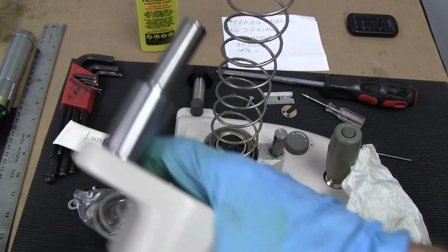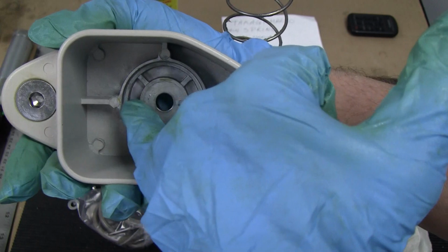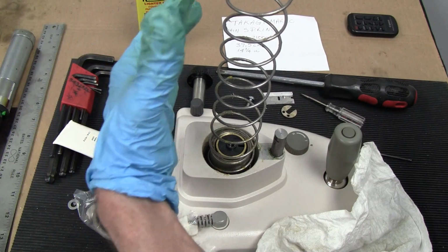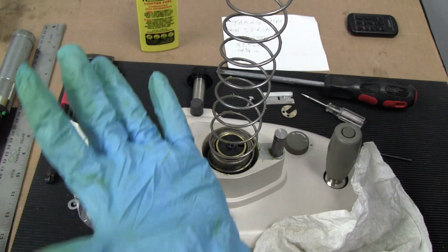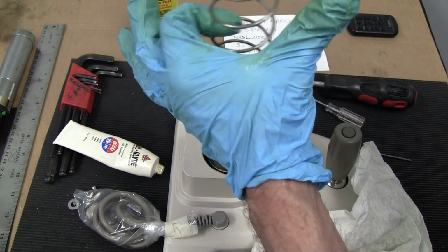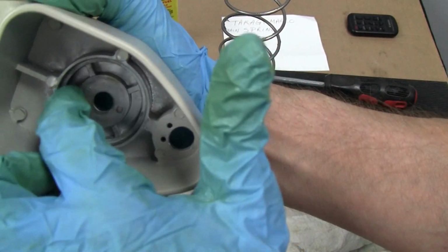Once we have our spring back in position, greased up, then we're going to put our lift arm back on, being careful to make sure our spring goes in here, and our keyway is going to line back up with the keyway of the shaft. So you're going to put your hand in front of the spring so that you can stabilize it. And you're going to rub a little bit of grease off on your hand, but if you coated everything and put a lot of grease around here and on the inside, well, that's what's important. It should be okay. But make sure you start off going inside that little rim.